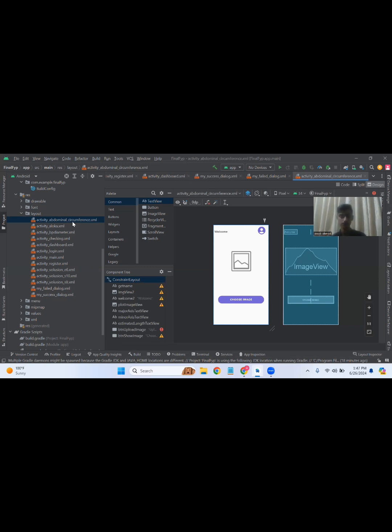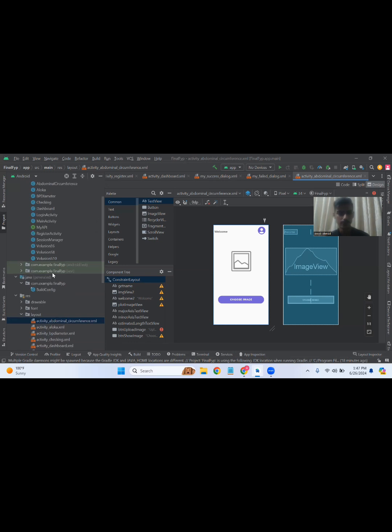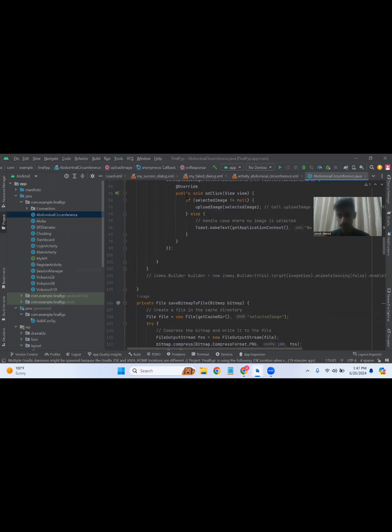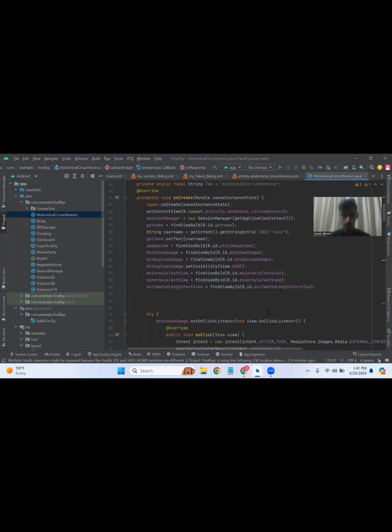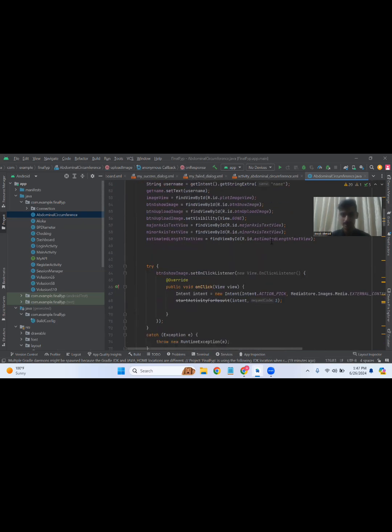We have trained our entities for that. As you can see here, we have our UI for our trained models, from where we can get these. If we go to the back end of this code for abdominal, here we are. Here, we just declare all our buttons and text views.